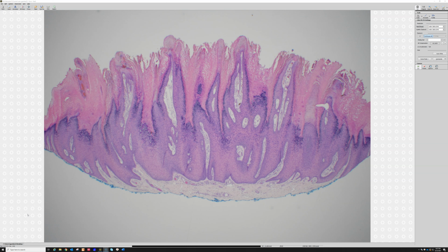So the first thing about a verruca is you're going to have acanthosis, thickening of the epidermis, right? You can see the epidermis over here, I think this is actually the dorsal hand if I recall. You've got about this thick epidermis here, but then in the middle, look, the epidermis is very, very thick. In addition to that, you have these finger-shaped projections on the surface. That's called papillomatosis. Papillomatosis is a hallmark feature of most verruca. There are some exceptions, but these finger-like projections on the top and thickening of the epidermis.